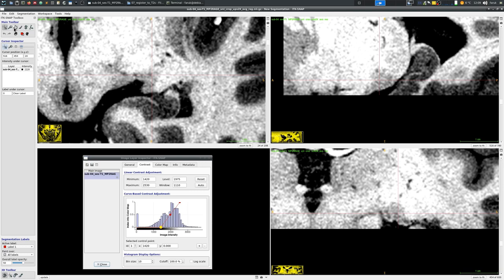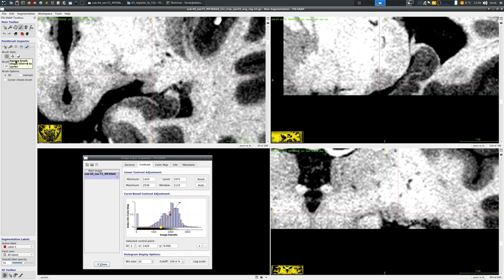After adjusting the contrast now I'm going to show you the brush option that I'm clicking right now. Here you can have access to several different brushes in ITK snap and the important parameters are selecting the brush size and the brush shape that I'm going to show you soon.